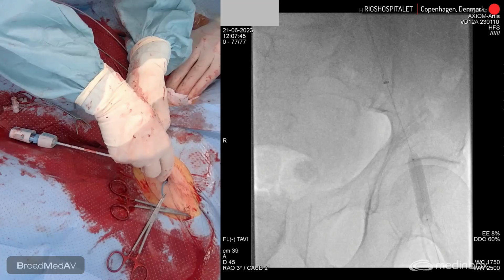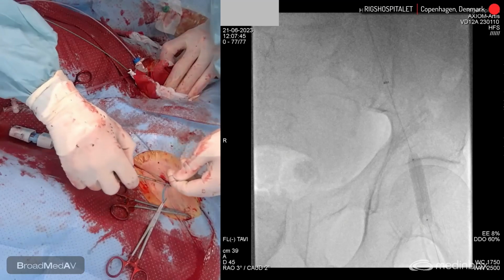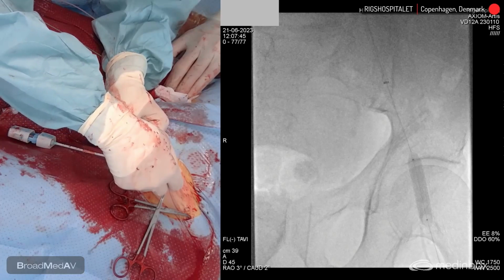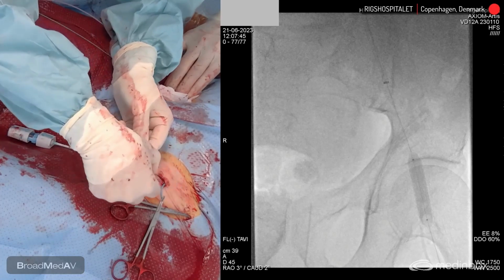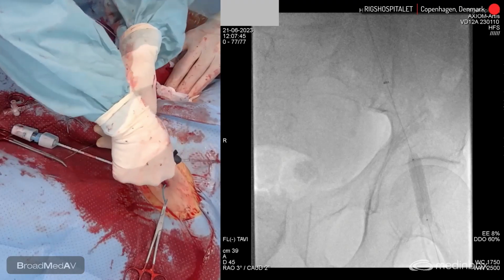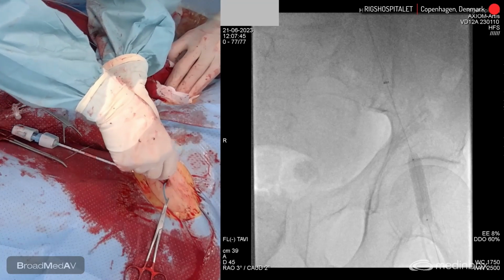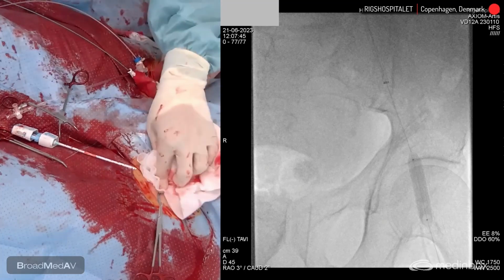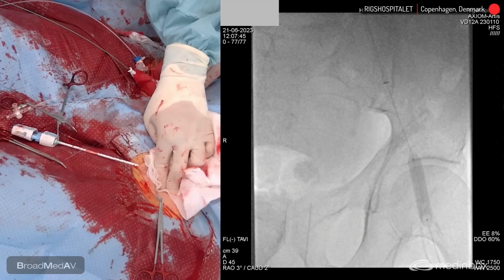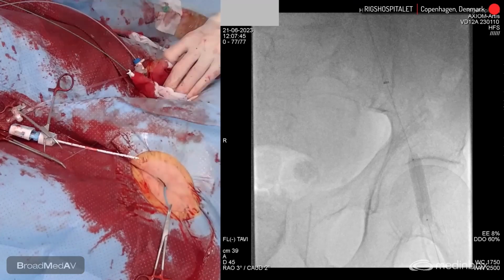Yeah, you see, we prefer, instead of having the patient have major bleeding and compressing a lot and losing a lot of blood there, to prevent it and do it the safe way. Then the patient can mobilize quickly. We have 0 tolerance for vascular leakages at the table because these patients have to go home tomorrow. And he will go home tomorrow for sure because his ECG is good, his valve is good. It's just all depending on his vascular access, so we should have 0 tolerance there, I think.